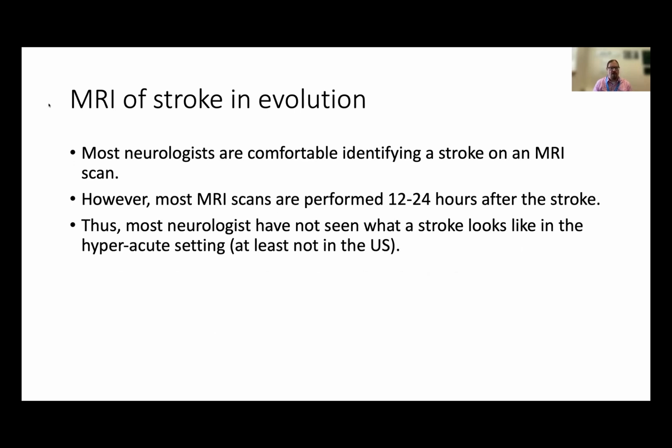So most people haven't really seen what an MRI looks like in the moments after you've reperfused a stroke. And most people actually aren't that familiar with getting MRIs before you reperfuse the stroke either, at least not in the US, more common in Europe.